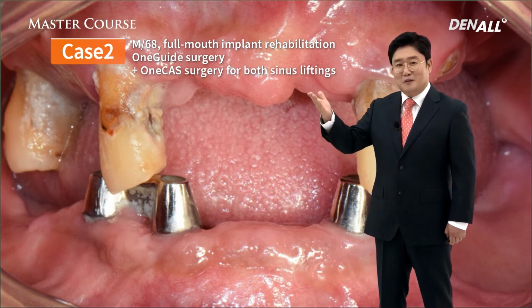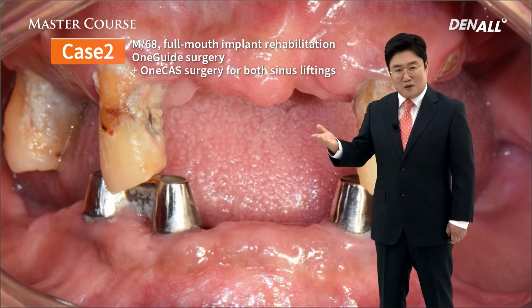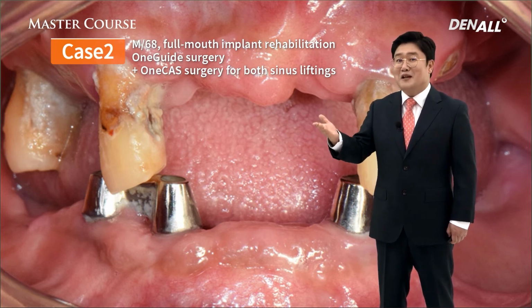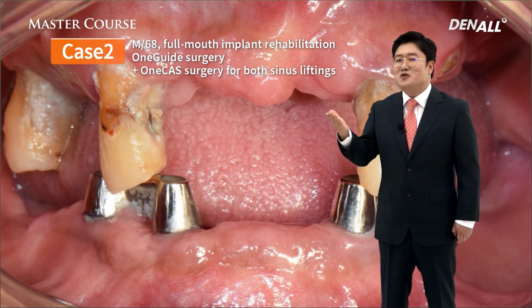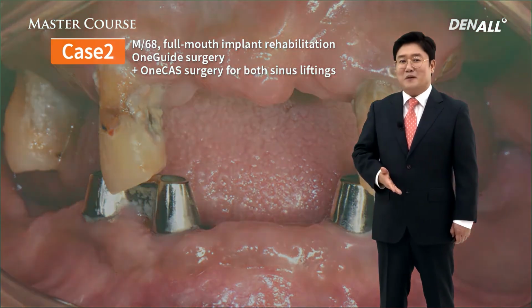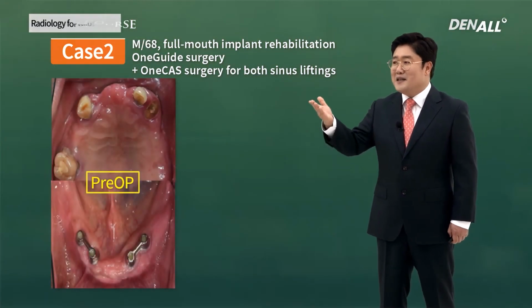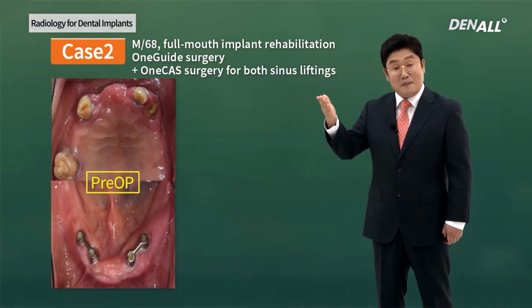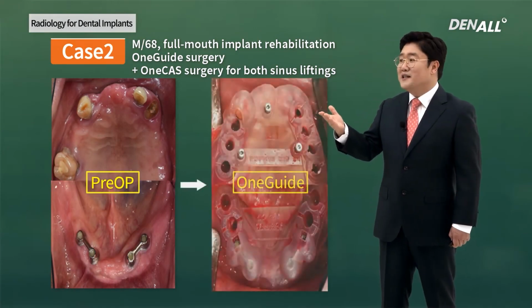In this case, One Guide and One CAS, which is dedicated for sinus lift, can be used to provide comfortable and easy full mouth implant rehabilitation. That's what was done pre-op. The remaining teeth will be extracted, but that will be utilized.